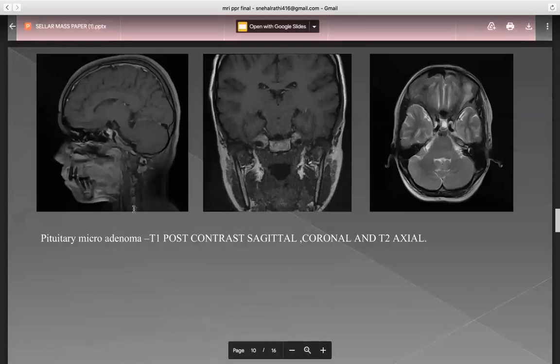Following are the images of pituitary microadenoma — T1 post-contrast sagittal, coronal, and T2 axial.